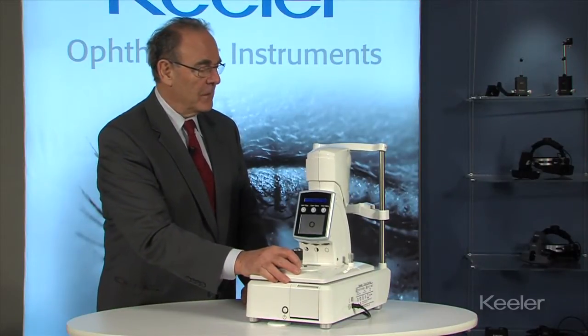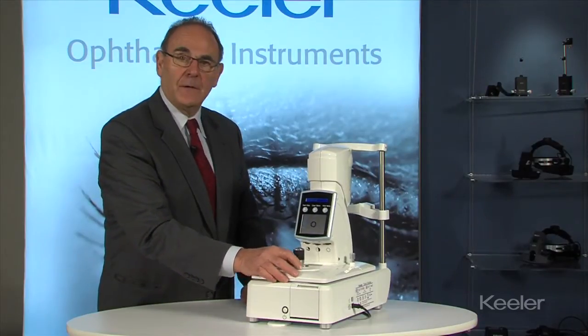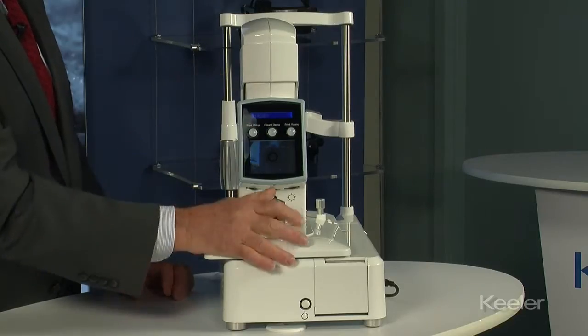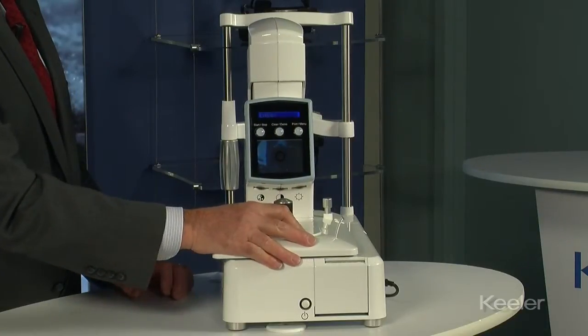The alignment of the instrument itself is achieved by moving the platform, and when you move from left to right it will register on the screen and also be shown on the printout.